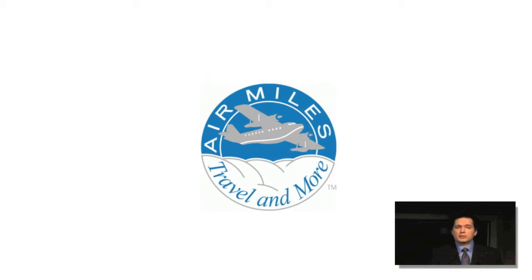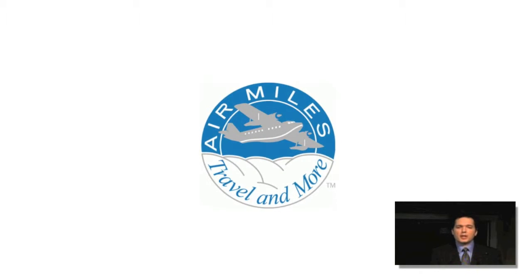Some might say, well, how sustainable is this? This actually costs money. Well, it's not costing all that much. For someone who's perfectly adherent, we're spending about $3 to $4 a week on iTunes redemption codes, so it's not a lot, especially when they're spending about twice that much on strips per day as well. We're also going to try this in the adult type 2 diabetes population, and we're changing it from iTunes to Air Miles. Paul Ritvo, my collaborator from York University, is working on this with BlackBerries, using Air Miles. But again, we're thinking about the long-term sustainability of this.